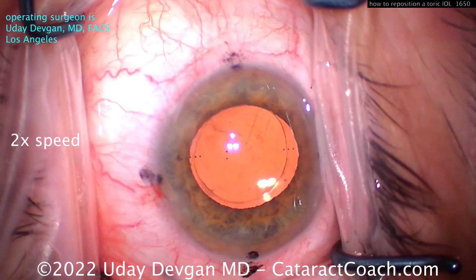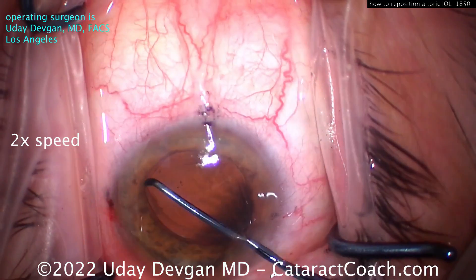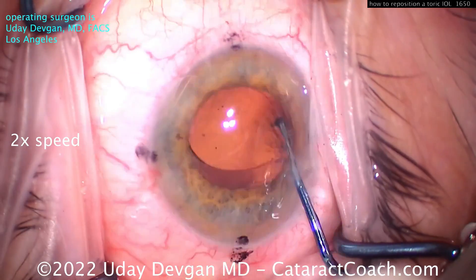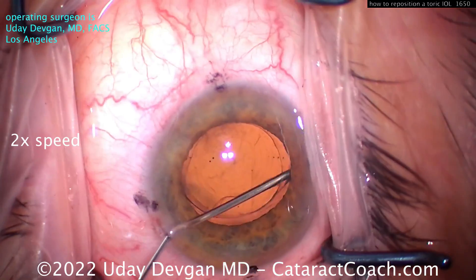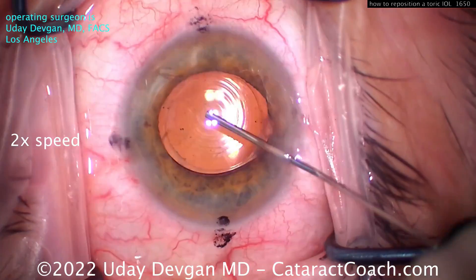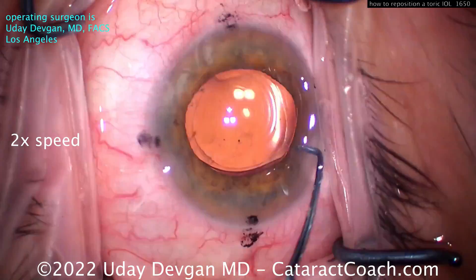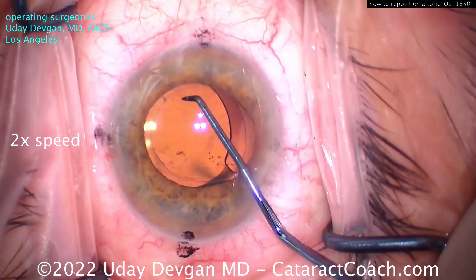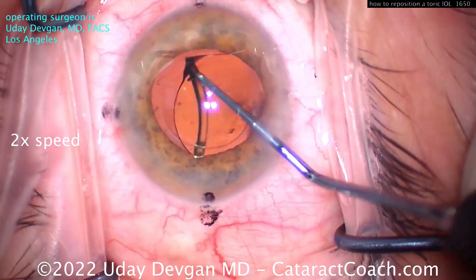Also spread it back to open up the anterior and posterior capsule leaflets — you want the lens capsular bag to be open out to the equator. Now we can try to lift the lens up and get the haptics out. These haptics on this platform have a bulbous tip, so if it doesn't come out, don't force it. Instead, inject more viscoelastic to open up the capsular bag all the way out to the equator to free the optic. Now it rotates and we can pull it up — it's totally free.